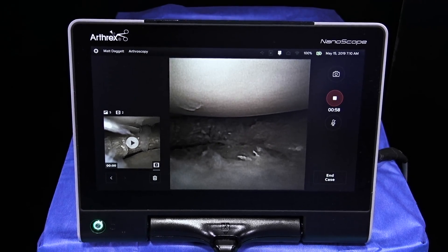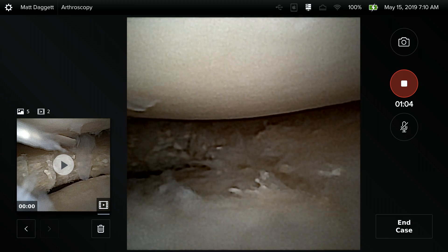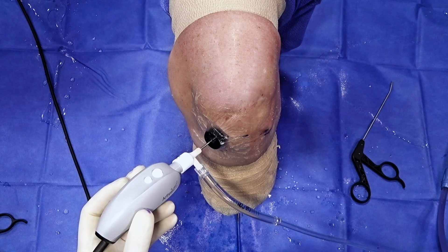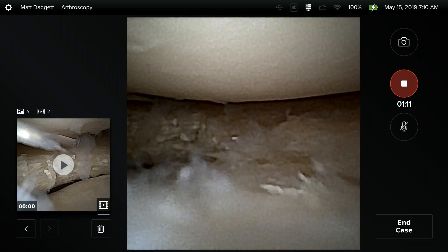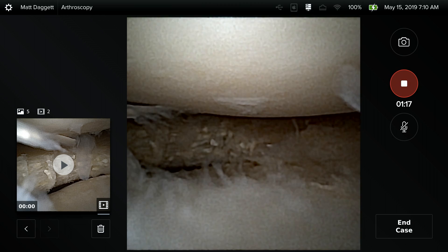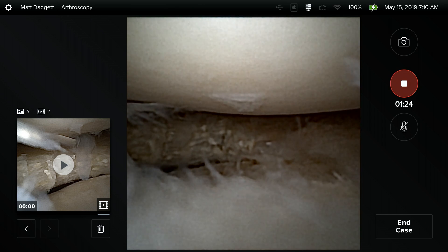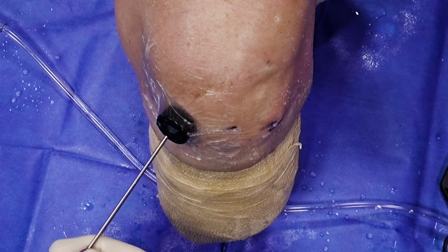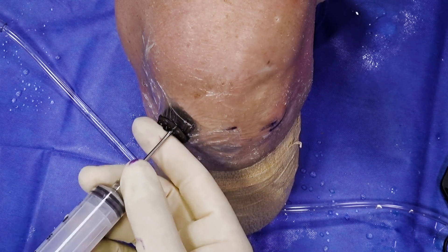A nice feature of this Nanoscope medical grade console is the ability to capture video and annotate with voiceover in real-time during the procedure, which you can share with the patient thereafter. One of the biggest advantages of the Nanoscope is its ability to improve and enhance the patient experience and recovery. By educating the patient about their condition and using mainly local anesthesia with reduced general anesthesia, the recovery time of these procedures is significantly less than what is traditionally performed with standard arthroscopy.